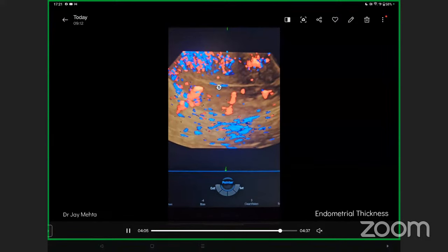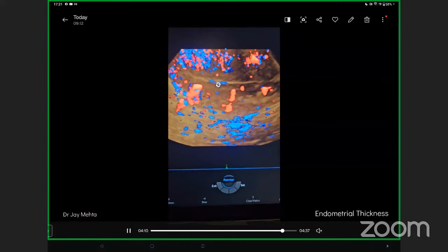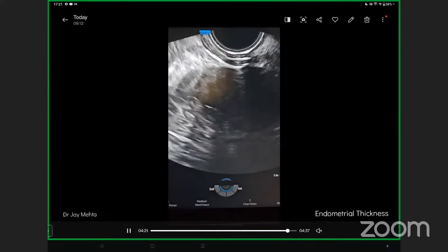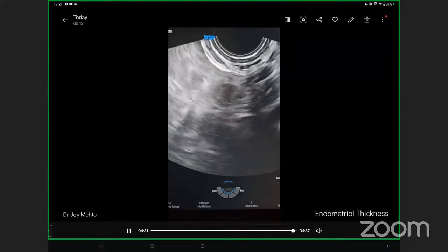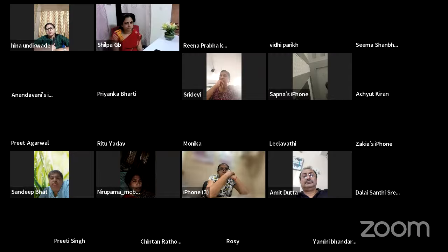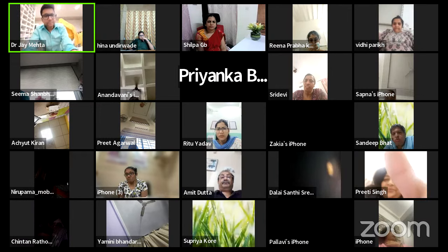You can see beautiful vascularity when screening through this endometrium on all three axes, entering right inside the center — this is a very healthy endometrium. Beyond this, we don't go into the depth of assessing each vessel's RI, PI, or peak systolic velocity — we normally don't do that. Once we have finished the uterus, we go to one ovary — the ovary appears quiescent — and then the second ovary, which is also quiescent with no follicle more than 12 millimeters.